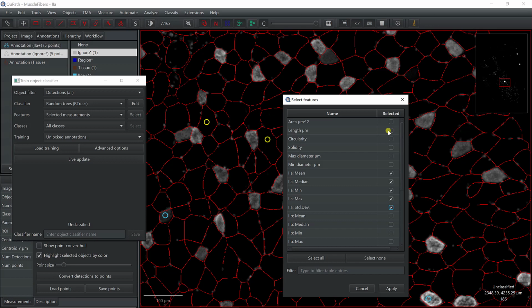So when I try to identify positive 2B, if I use the 2B intensity and the 1, then if we have negative examples with 1, even though there's some fluorescence associated with 2B, the classifier is going to find it easier. It's going to know that if you have high 1 fluorescence, it cannot be 2B.